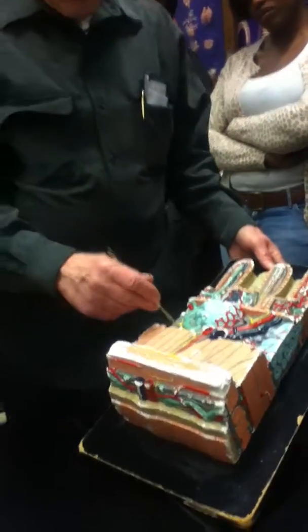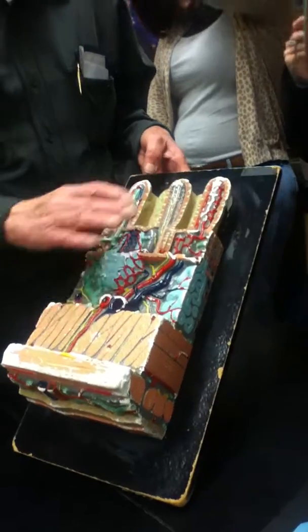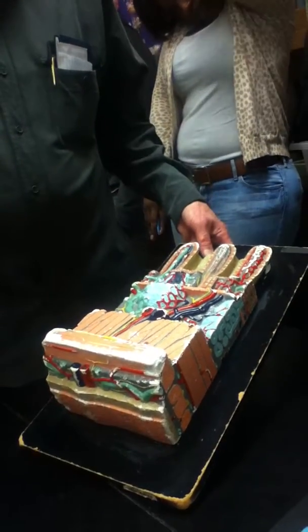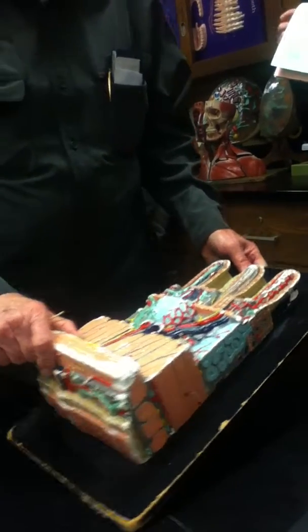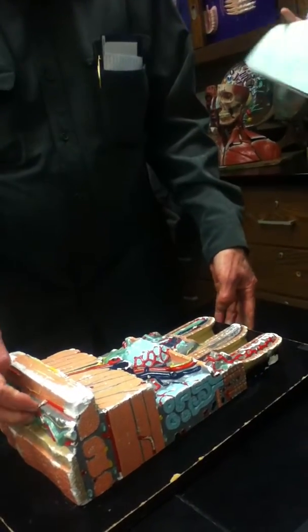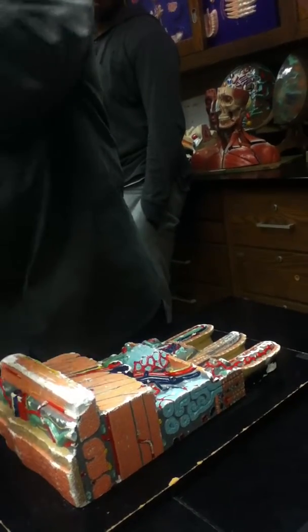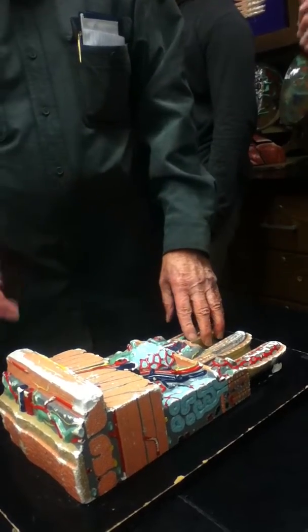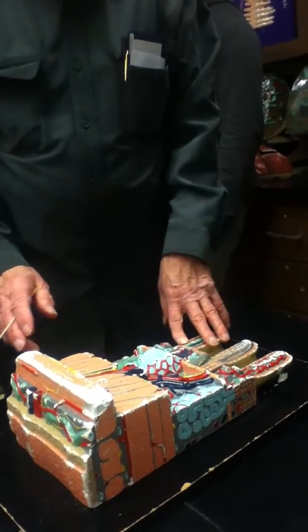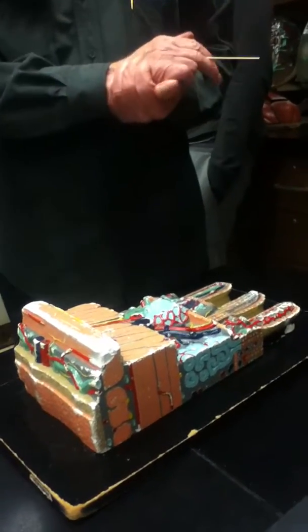One other thing, the gray stuff. Anything gray you see on these pictures, that's connective tissue. It's got a specialized name. What's the name on there? No, not serosa. Serosa's out here. Lamina propria. Lamina propria, two words. Anything gray, call it lamina propria. It's connective tissue.